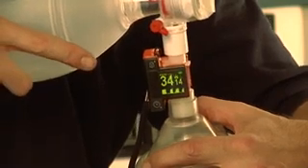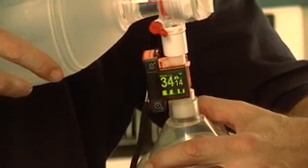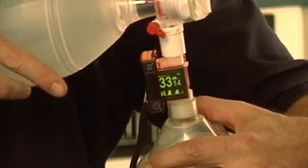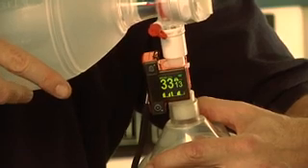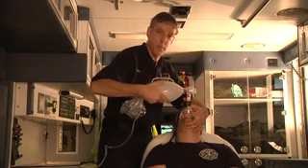Using a device like this allows you to not only see the rate at which the patient's breathing, but also to time your ventilation and choose a rate that gives you sufficient respiratory effort in the patient, measured by exhaled carbon dioxide. Keeping that exhaled carbon dioxide between 35 and 45 will allow you to pick the ideal rate for the patient.